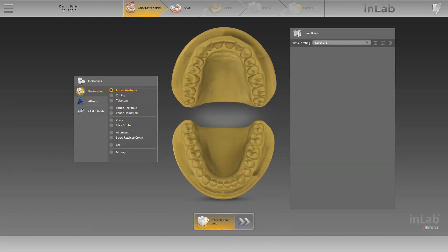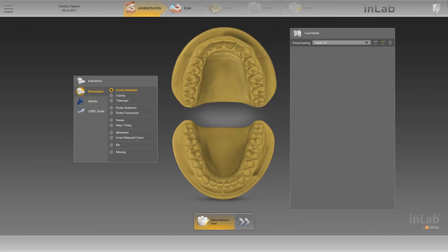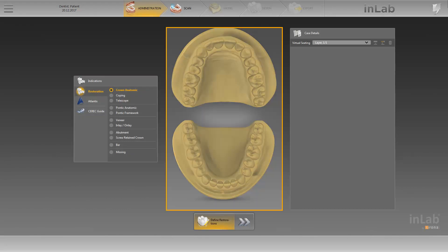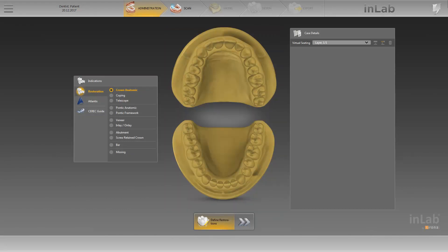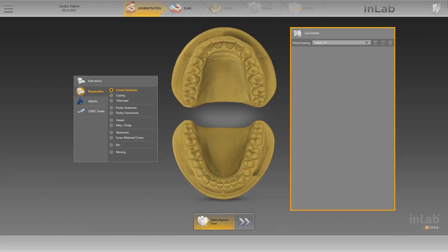The basic procedure in the administration phase has changed with the new InLab Software 18.0. You stay in the same view throughout the entire administration phase, first selecting the indication on the left, creating it in the odontogram, and then specifying the case details on the right.